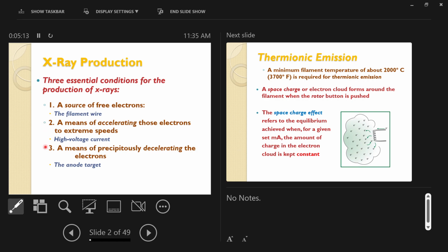And then you need to run those electrons into something, right? A car moving fast down the road carries a lot of energy. That energy doesn't necessarily do anything, except move the car down the road, but it doesn't do anything to any object until it hits a wall, for example, right?